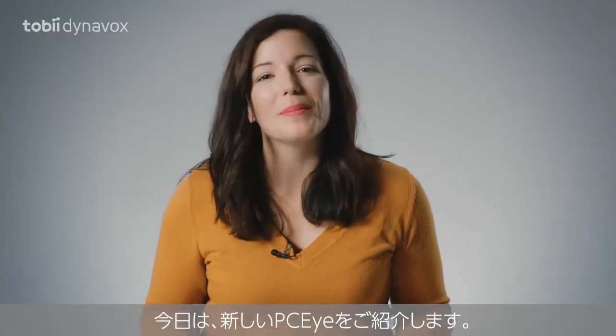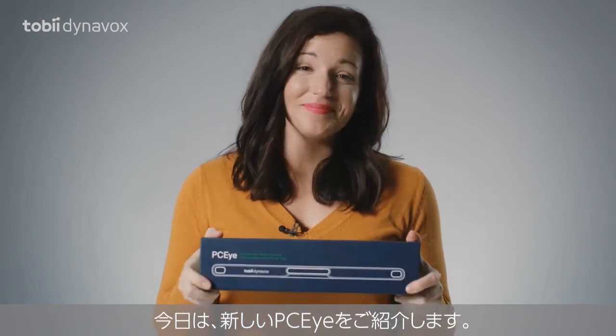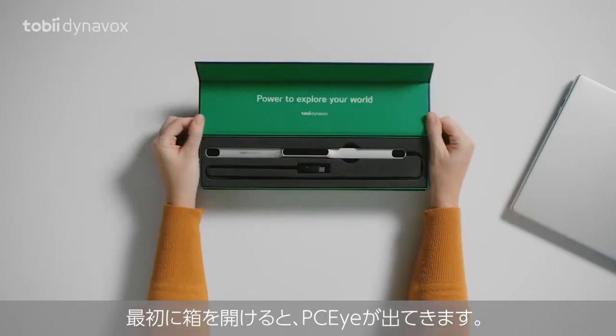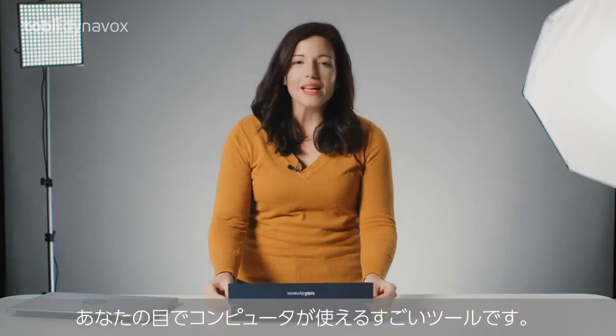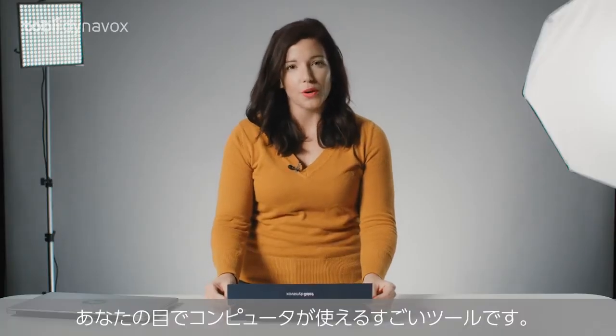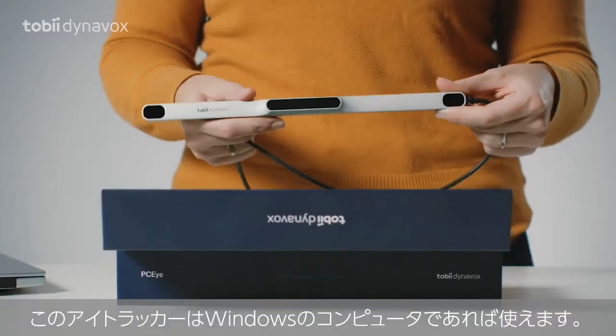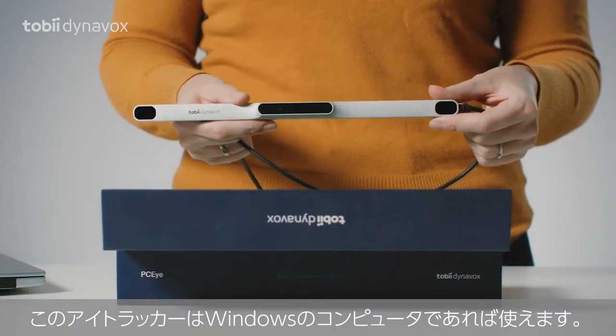Today we will be unboxing the new PCEye. The first thing you'll see when opening the box is the PCEye, an amazing tool to access your computer with your eyes. This is especially helpful for people with disabilities. And this eye tracker was designed to use with any Windows computer.